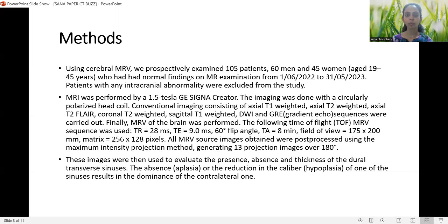MRI was performed on a 1.5 Tesla GE Signa scanner. Imaging was done with a circularly polarized head coil. Conventional imaging consisted of axial T1 and T2-weighted images, axial T2 FLAIR images, coronal T2-weighted images, sagittal T1-weighted images, as well as diffusion and gradient sequences. Finally, MR venography of the brain was performed.